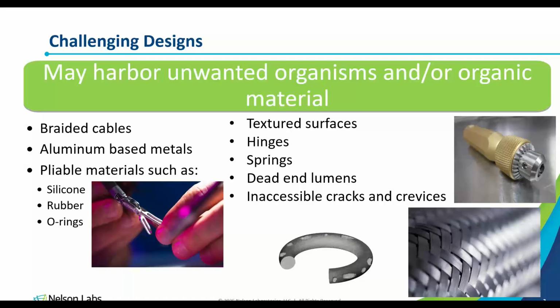That is an excellent question, because that's the hardest part. You are in the design phase. You may not have the physical device, so it may not be possible to do some sort of feasibility test to determine its cleanability, or if it can be disinfected properly.